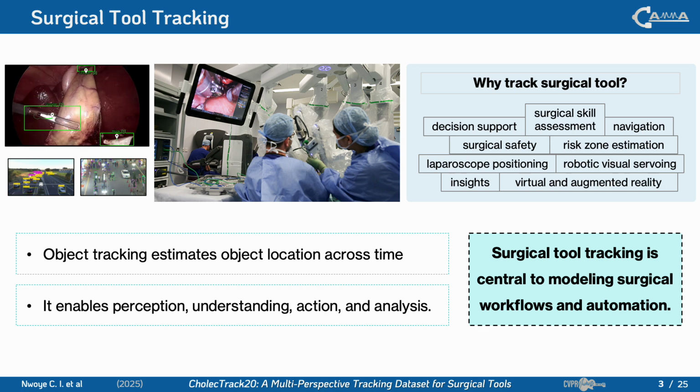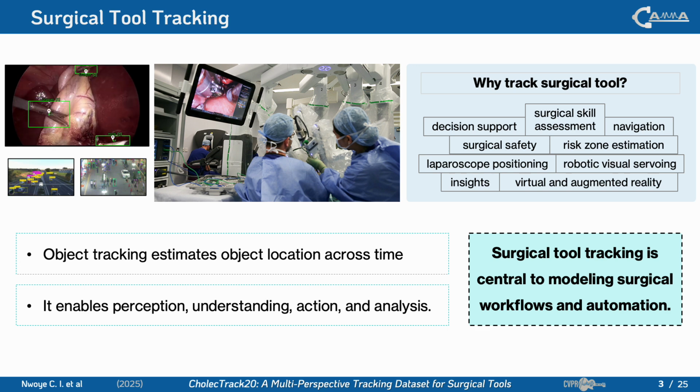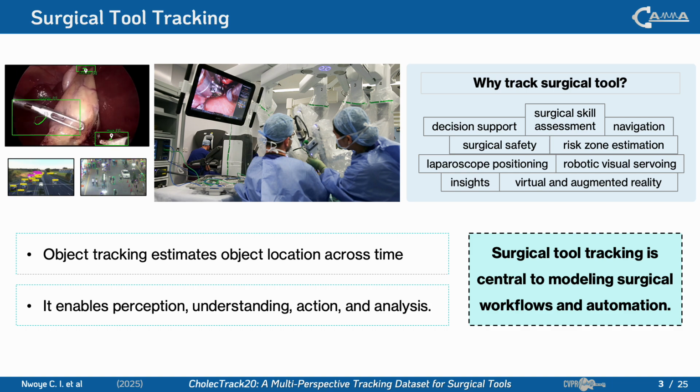Tool tracking goes far beyond localization. It enables the modeling of complex surgical workflows and supports downstream tasks like phase recognition, safety alerts, skill assessment, robotic control, navigation, and augmented reality assistance.